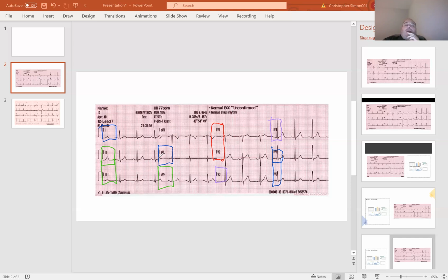Okay. So there's a term that we use called anatomically contiguous. Well, what does that mean? That means that they are sections that belong to the same coronary artery supply. Okay. So if you're asking, okay, cool, we're breaking these things off into sections, why do I care?